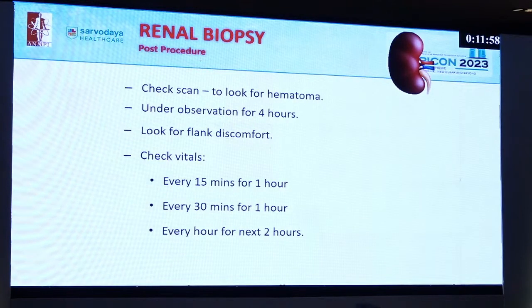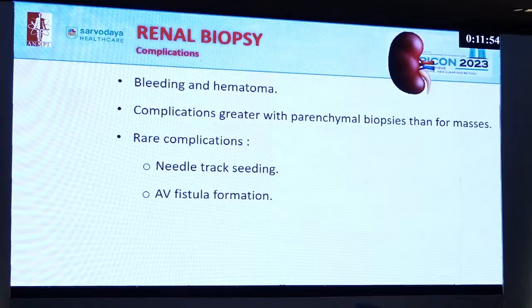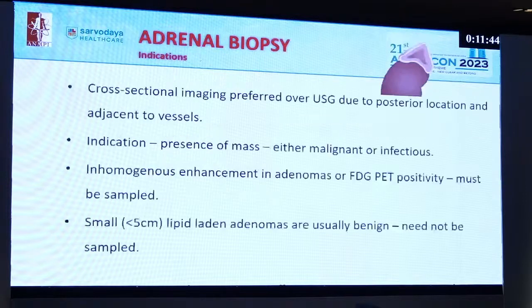Now, post-procedural care is almost the same. Vitals should be checked. Now coming to the complications, the patient may have bleeding and hematoma, and needle track seeding will be there. AV fistula formation may sometimes happen.